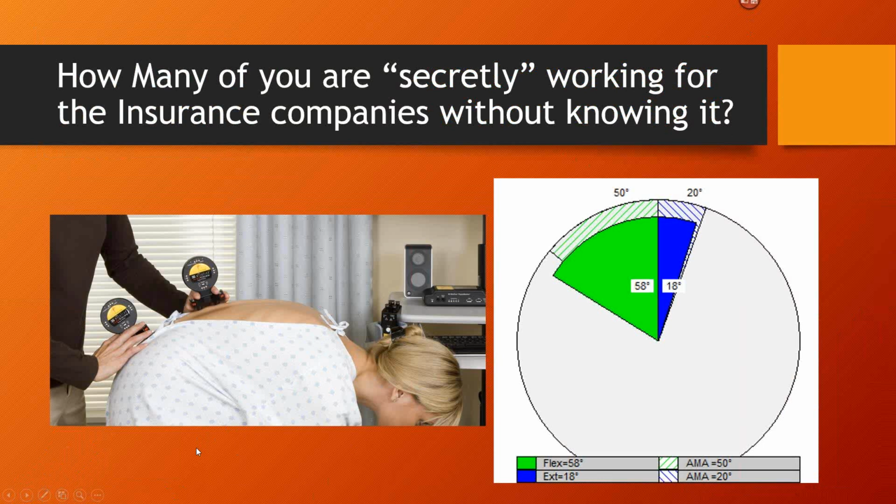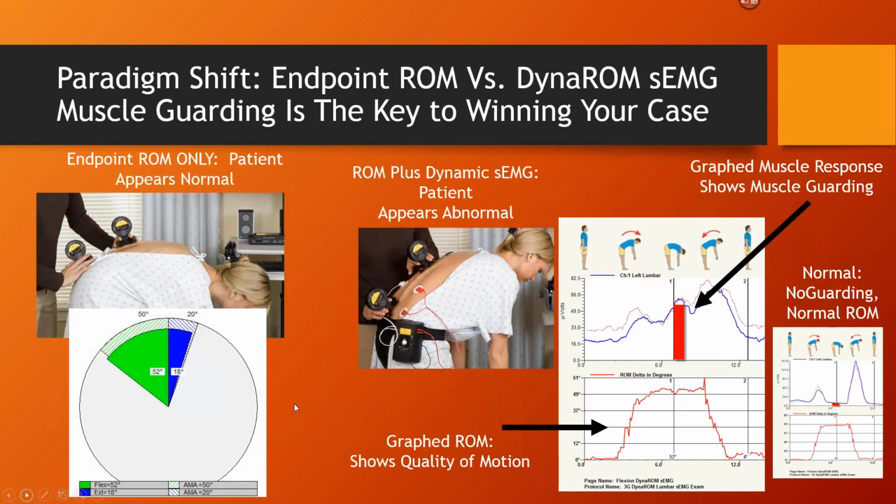One of the docs who does a lot of PIs, I think about 40 or 50 clinics follow him. He started using the MyoVision about a year ago, and he called me about 2 months ago and said, "Oh, I finally get it." He said, "We've been documenting when they're in pain when they have normal range of motion by writing down that they said, 'ow.' You're graphing the ow objectively," and that's exactly what's happening.